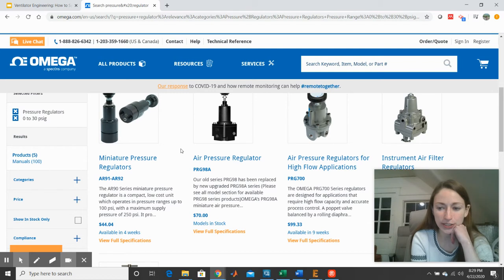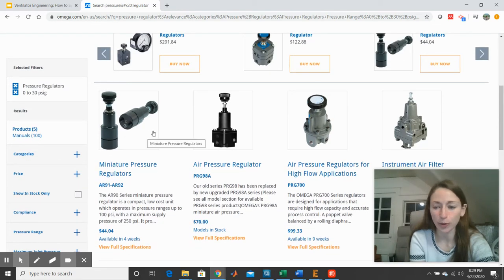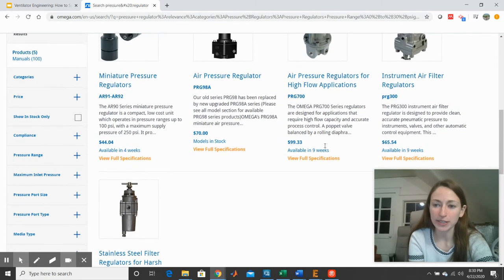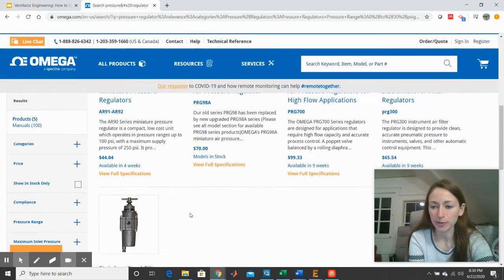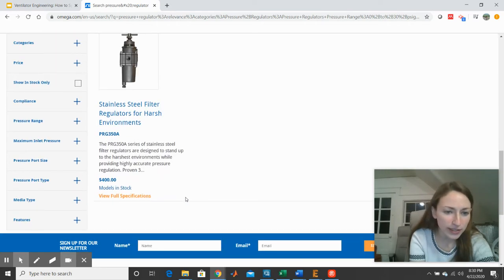So just skimming through what we've got here, we have these miniature pressure regulators. And immediately when I see these, I become worried that the CV won't be high enough. That's the flow coefficient. So I worry that these tiny little inlets will be restricting my airflow and it won't work for our application. We have some other pressure regulators. We have a high flow application pressure regulator. So that's pretty promising. And then more specialized things like regulators for harsh environments, which we don't necessarily have here. But all of these are worth considering.